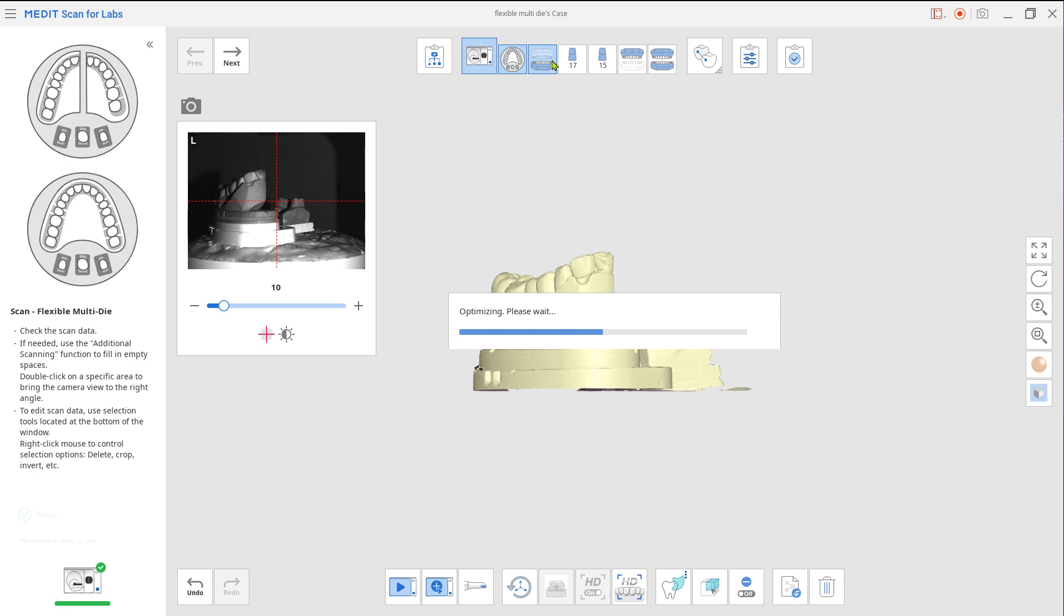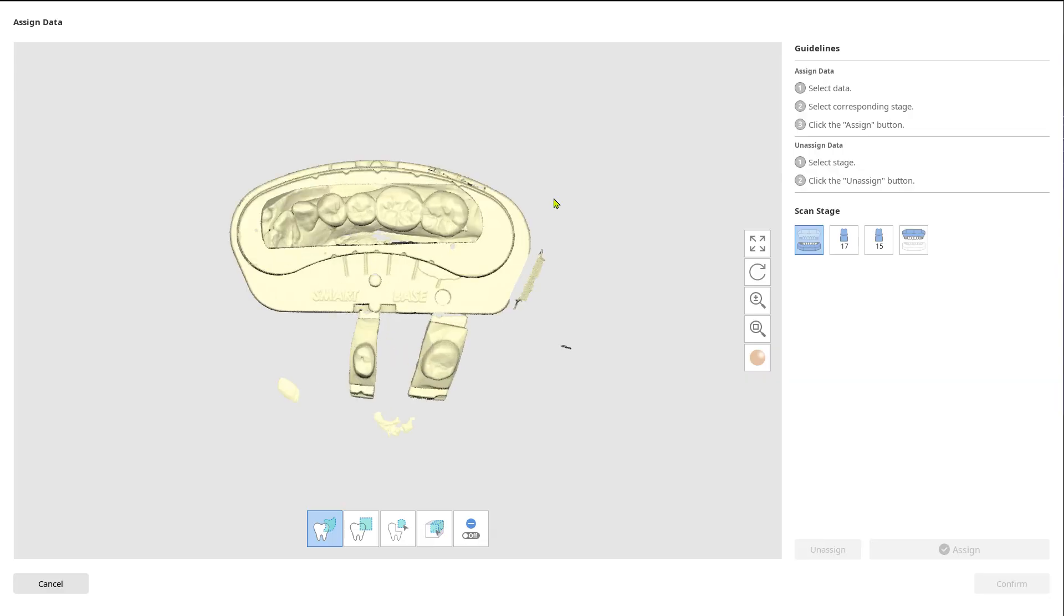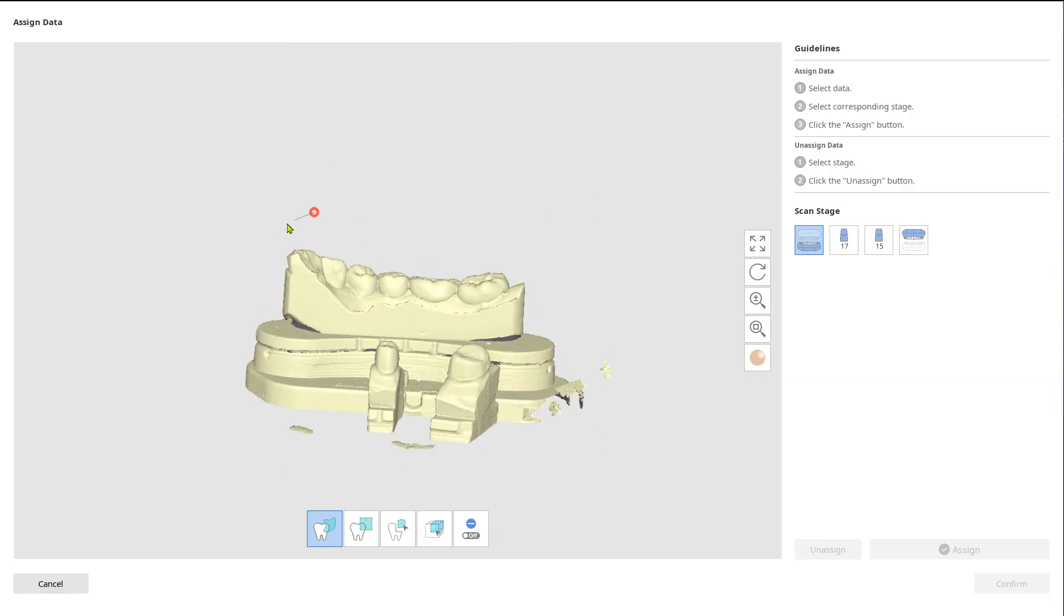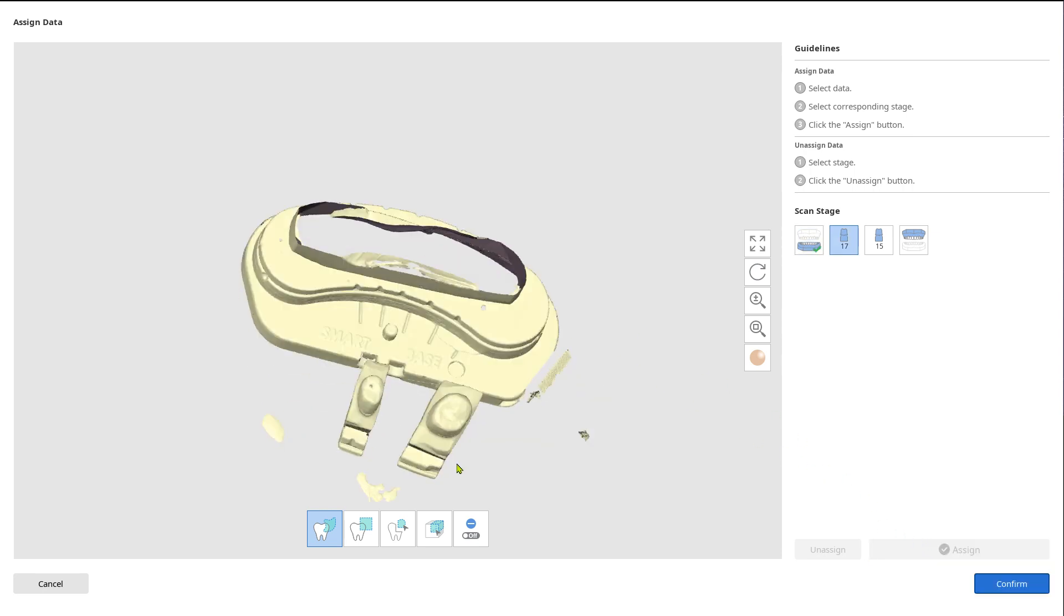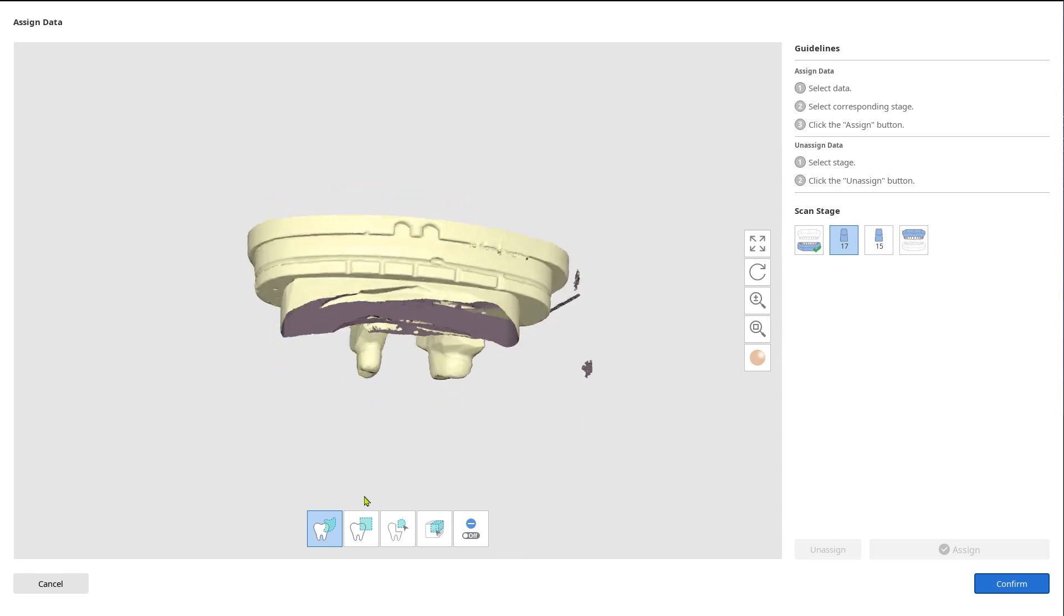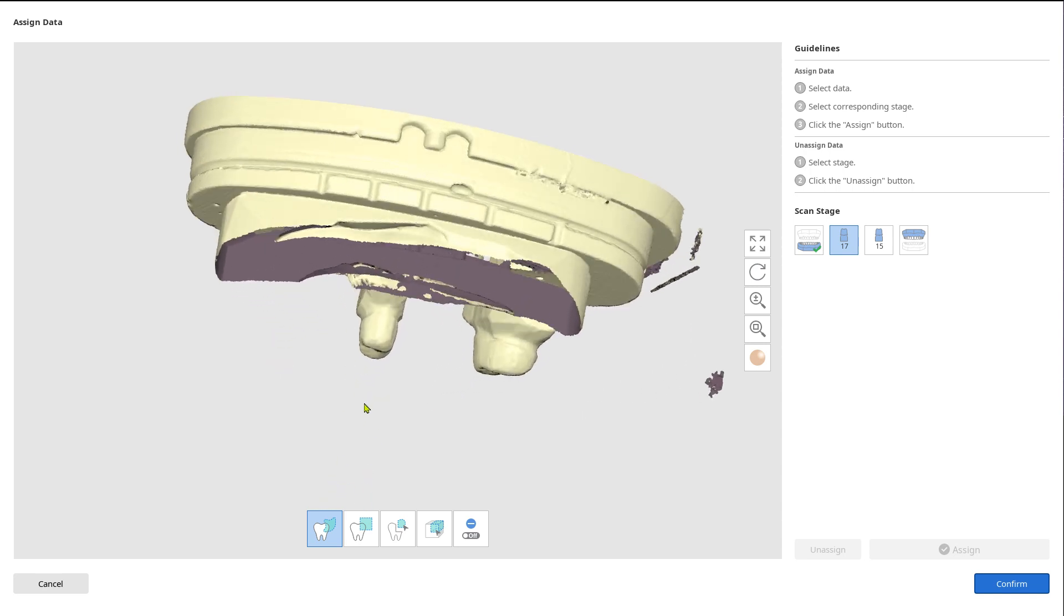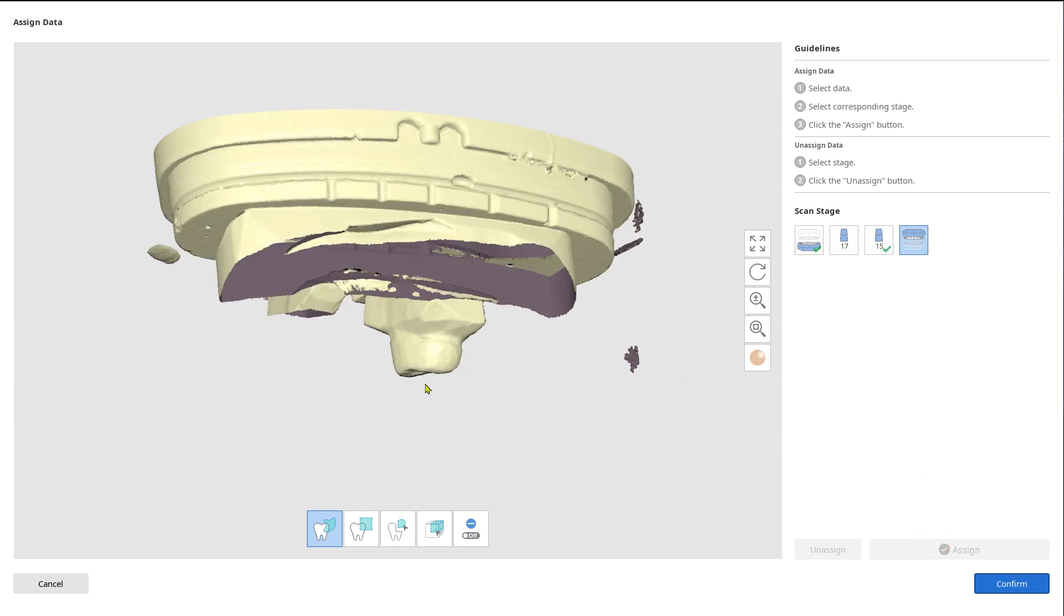Click on the mandible. Now select the data which belongs to the mandible and prep teeth from the maxilla. Use the island selection tool from the bottom to make any marks. Assign data to the mandibular base and the prep teeth one by one from the right scan stage.